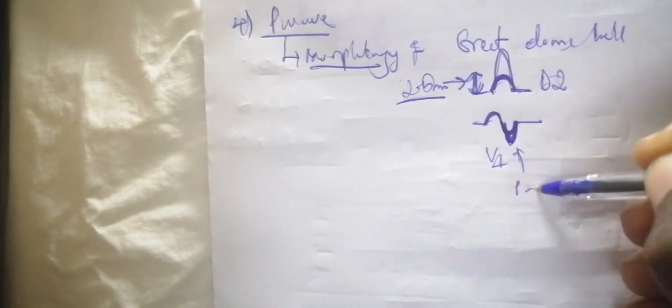And you can also have an increase in this part here, that's the P mitrale. When you have an increase in the negative portion of the P wave in V1, it's a P mitrale. And when you have an increase in the positive portion of the P wave in V1, it is the P pulmonale. Now, P mitrale corresponds to a left atrial enlargement, as we're going to visualize, and the P pulmonale corresponds to a right atrial enlargement. So this one corresponds to both left and right atrial enlargements we're going to see later.